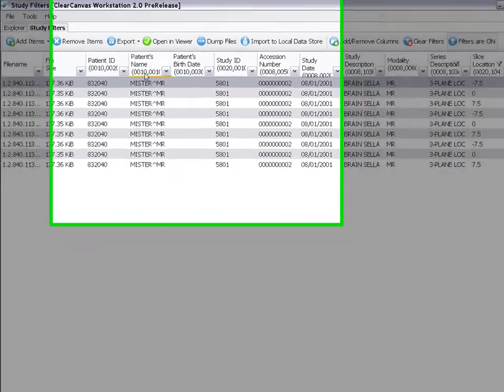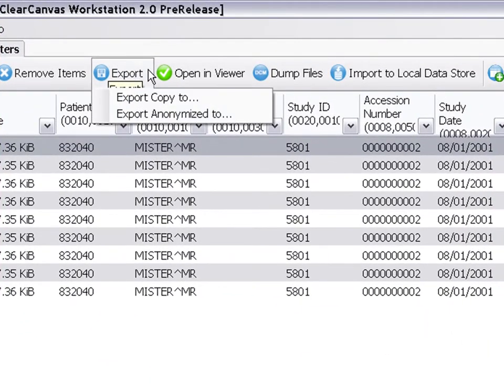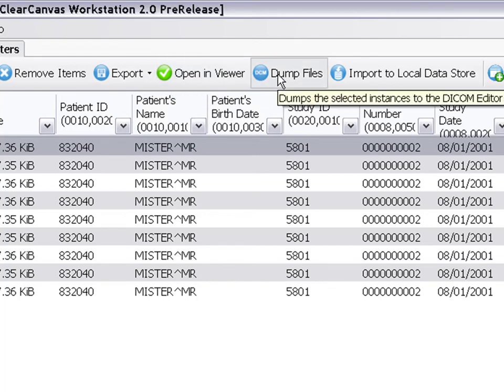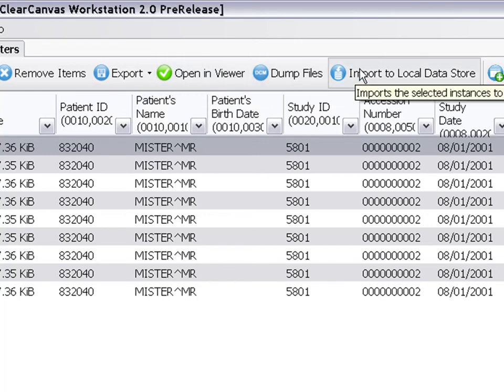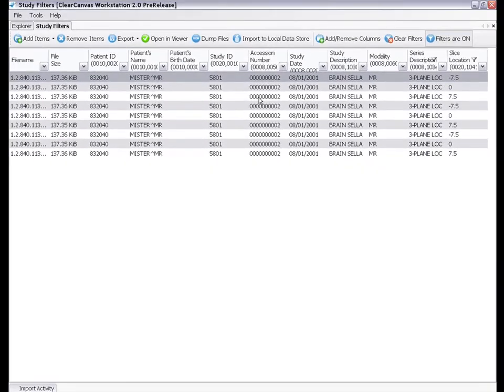Once the images have been filtered, you can do things like anonymize and export them to your local file system, open them in the Viewer, dump the images to the DICOM editor, and import them to your local data store.